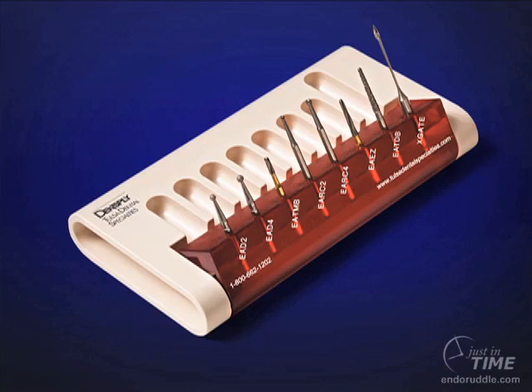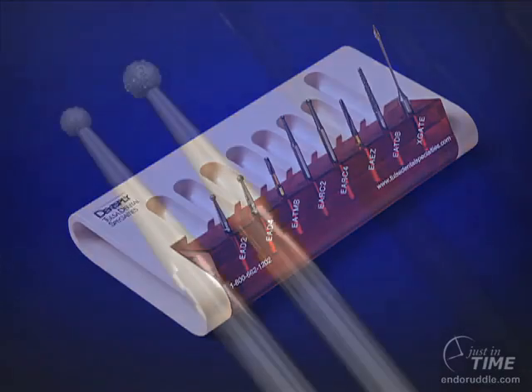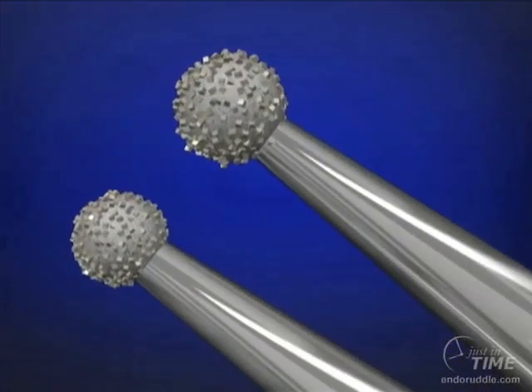We're going to go from left to right, and you'll notice as we go left to right, the burrs get longer as we move towards the right of the choices. As an example, we need a number 2 and a number 4 round burr diamond to get through tooth-colored restoratives. I use the larger number 4 to get through the occlusal tables of posterior teeth. On the contrary, we'd use a number 2 to get into bicuspids and anterior maxillary teeth and mandibular teeth. Using a number 2 is more appropriate because these teeth have smaller occlusal tables. Their cervical necks are smaller, and so this is more appropriate, so we maximize remaining dentin.